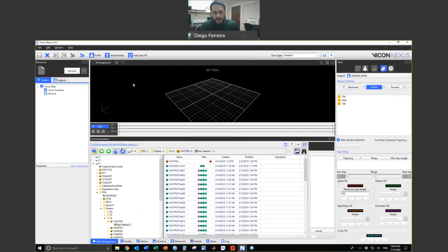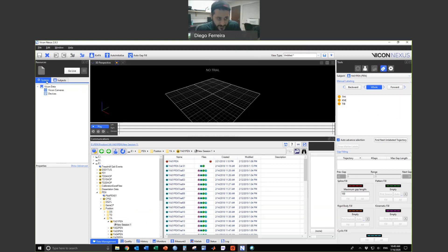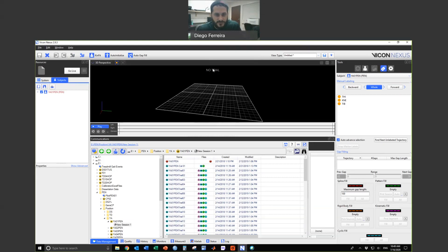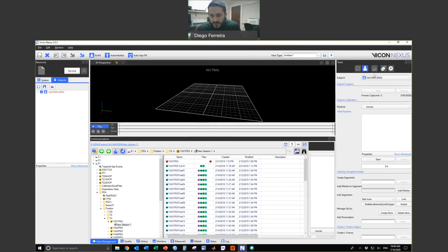I'll try to keep the video short so that if you need to find something later, you can do that. Over here in the Resources panel, it shows you System and Subject. System will show you all of the devices you use to collect data. Subjects is the subject information. Right now there's no trial selected, so there's no data.